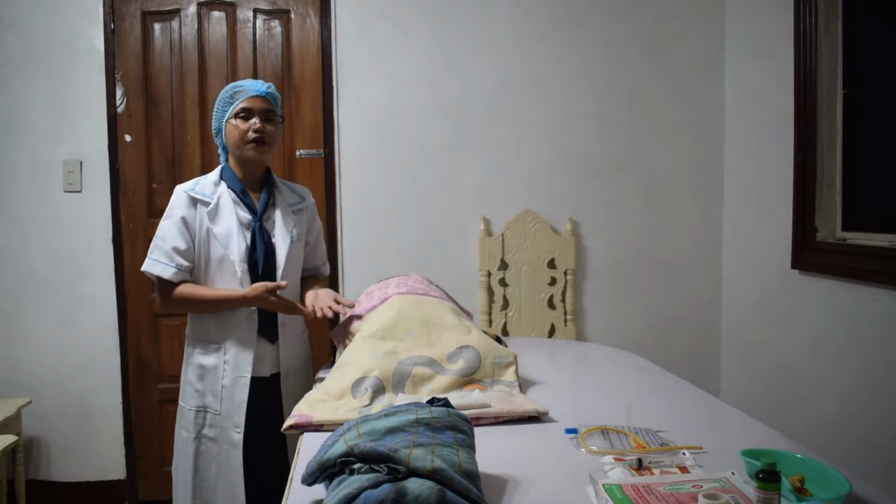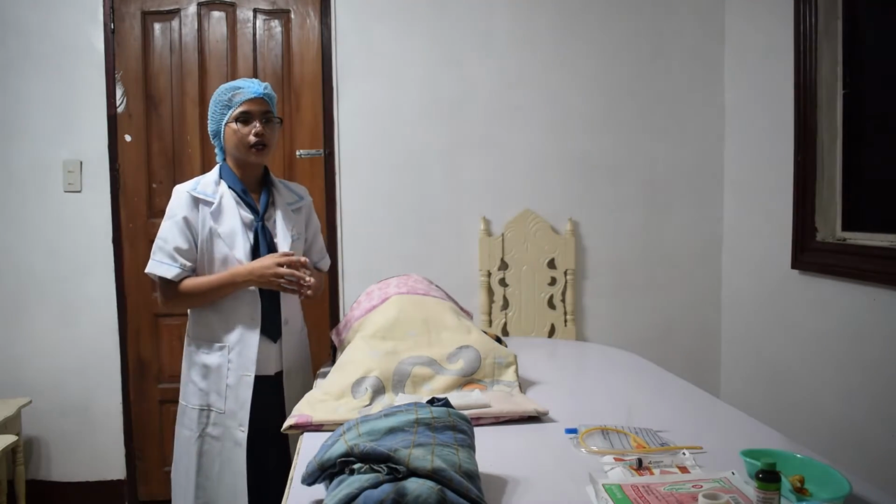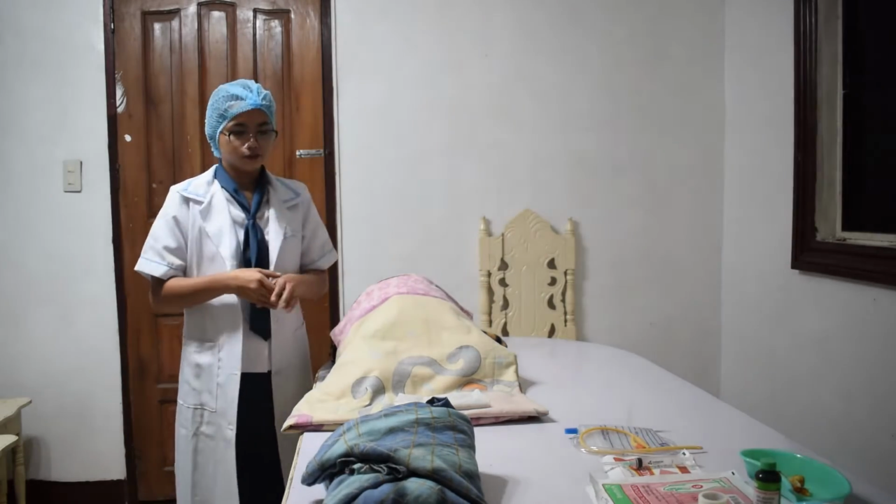Next is the implementation. For the catheterization, first introduce yourself and verify the client's identity. Explain to the client the procedure, why it is necessary, and how the client can cooperate. Reassure the client that he or she might feel a little discomfort during the procedure. Inform the client that the urge to void will disappear.